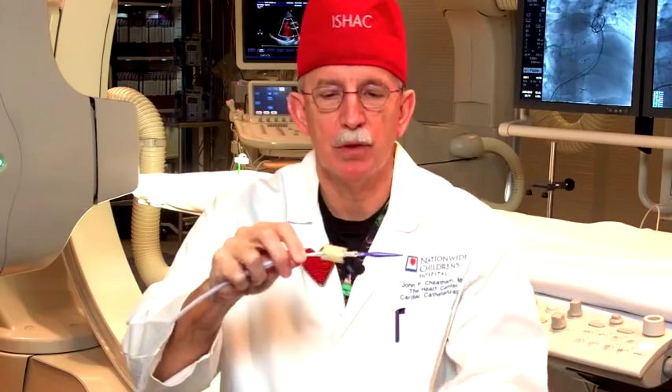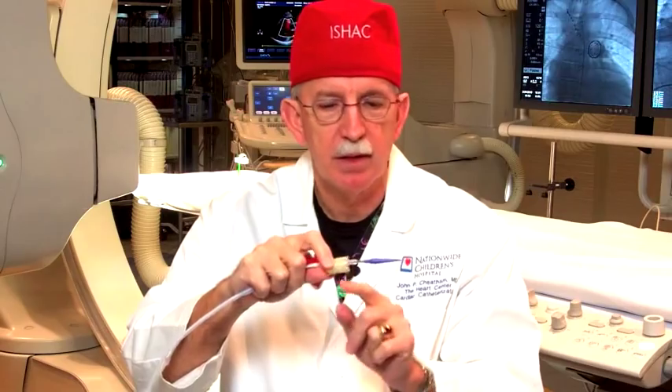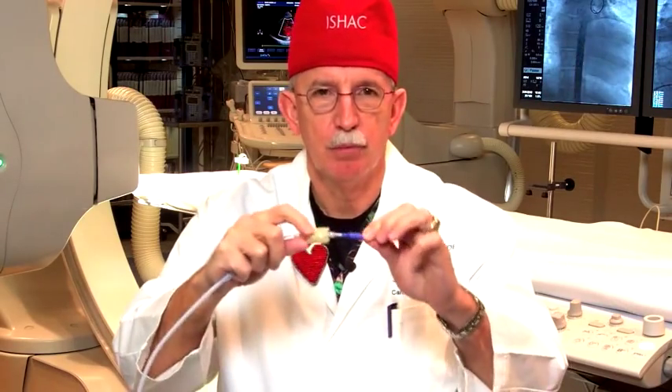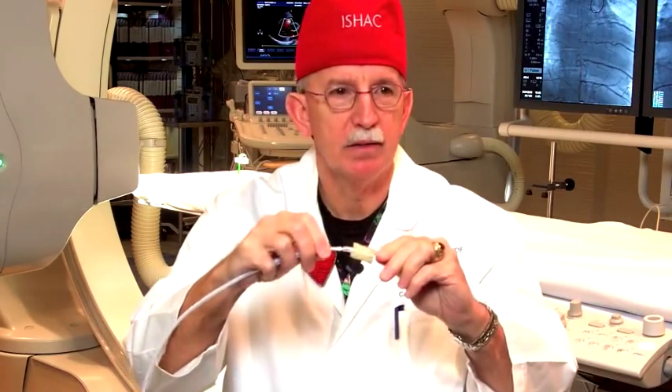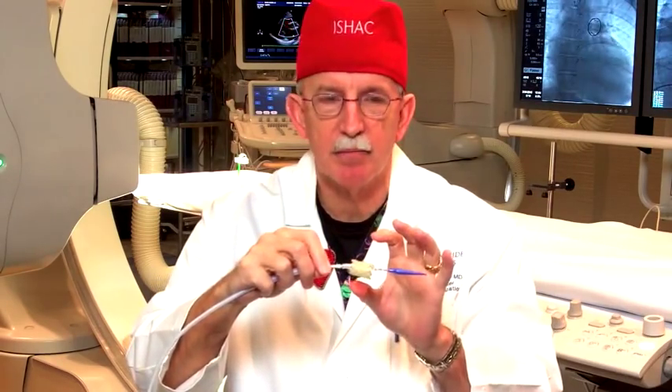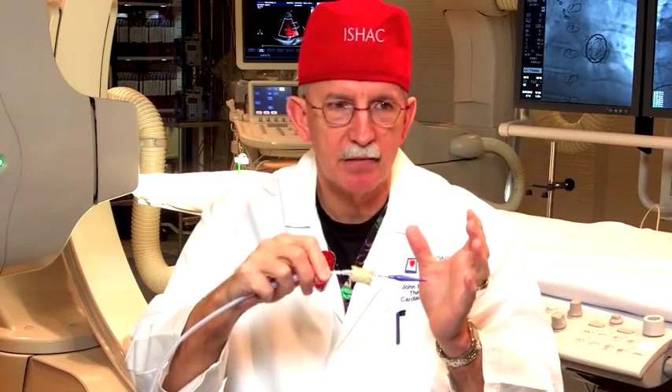You take this stent on a balloon catheter that we're going to introduce into the vein, and you place the valve onto the balloon. To make sure the valve is oriented correctly — right side up — there are blue sutures at one end and white sutures at the other end. There's the blue carrot and the white catheter, so blue goes to blue and white goes to white. That way the valve is always the correct side up, because otherwise you would put it in upside down, which would be bad.